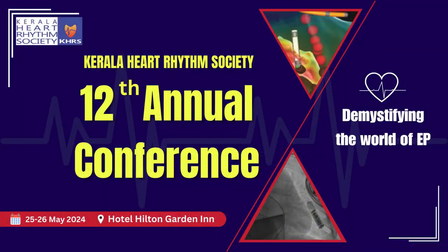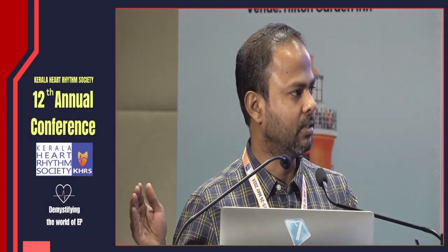When it comes to an alternative for CRT, with the wide right bundle branch delay pattern created by left bundle branch pacing, we have seen almost 150, 160 milliseconds QRS generated by the left bundle branch pacing lead with an LVAT of 90, 95. But when you do an AV delay optimization, this will automatically come down to 110, 120 milliseconds.